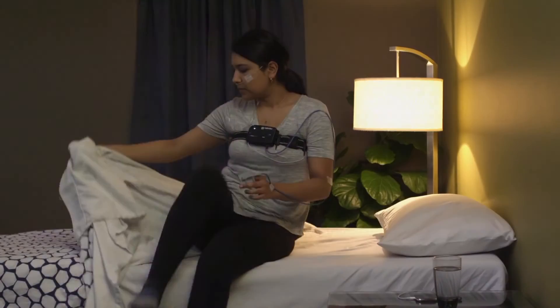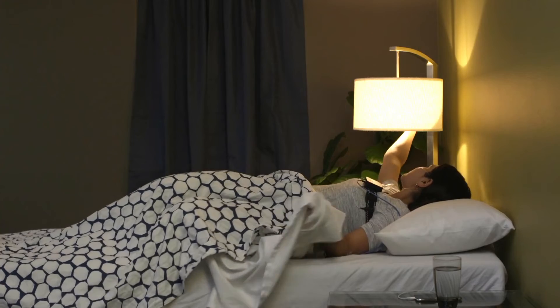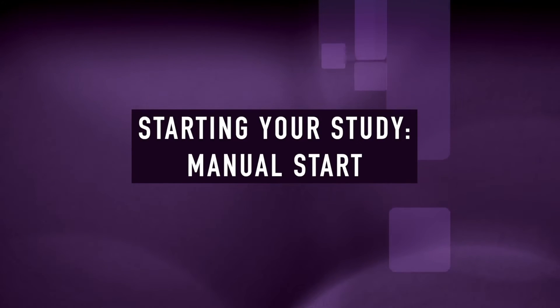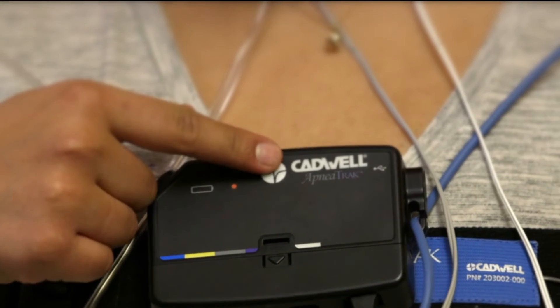If your provider set an auto start time, you don't need to do anything to start the recording. Just go to bed and the device will start at the correct time.